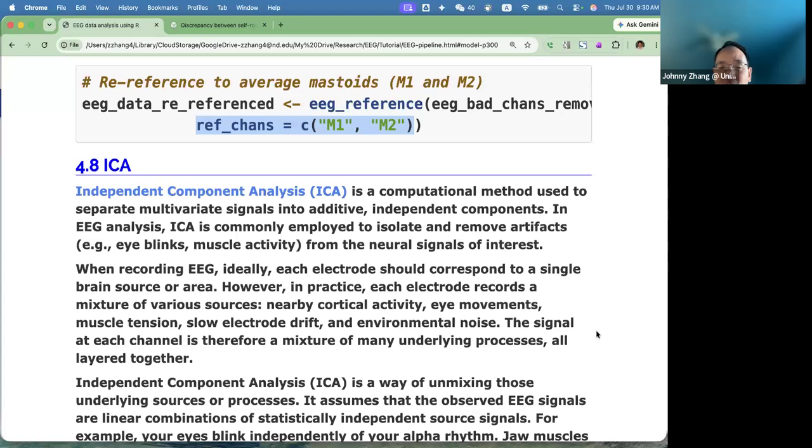It not only measures the information in the area we directly placed it at. It also measures the signals from the surrounding area. It also measures any change in your eye movement, your muscle, and even changes in the environment. For example, the electric grid will also influence the signal we captured.